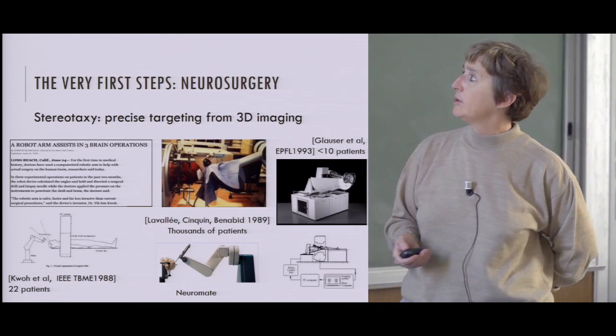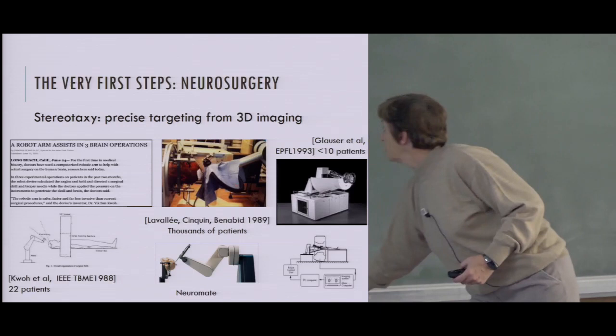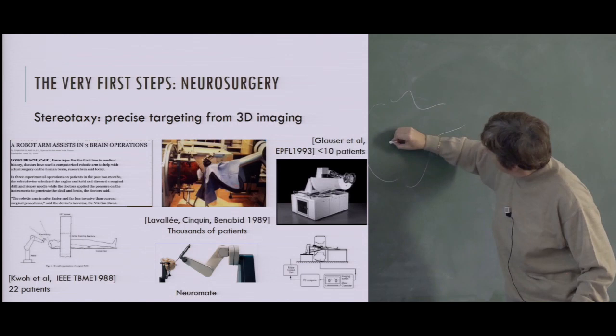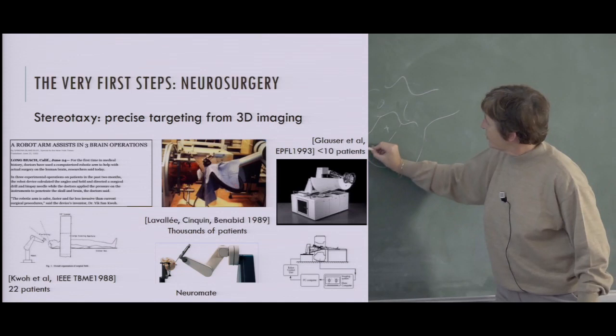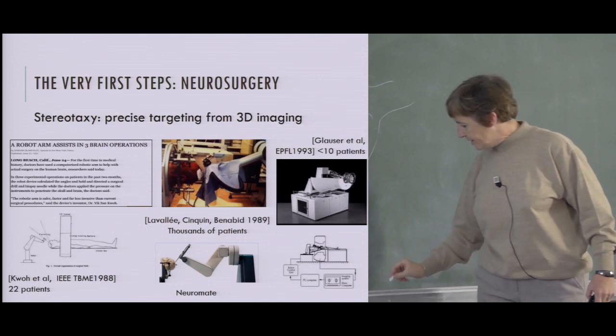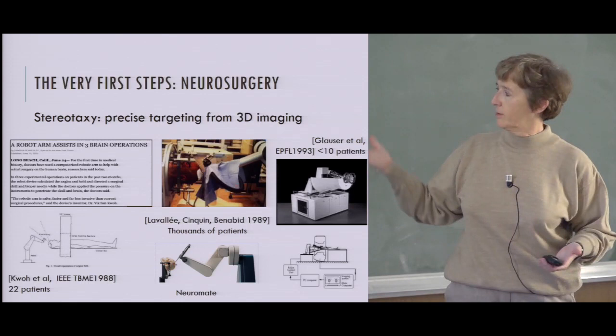You see, the first systems that were developed were for stereotactic neurosurgery. As I said, you have a patient and a brain, and you want to go somewhere here. Of course, you have to avoid vessels and critical regions. In fact, you have to plan a trajectory and access to that place. In general, these surgeries are mini-invasive, something like two millimeter diameter. But of course, the difficulty is to drill the hole at the right place with the right orientation to bring the tool in position.